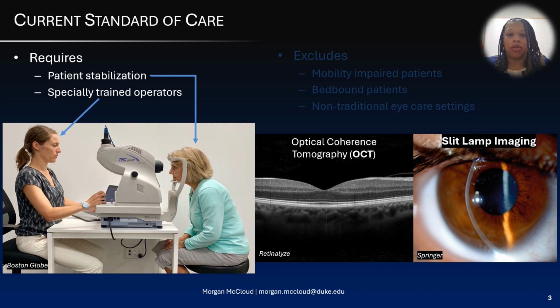This is typically used to image the back of the eye, our retina, and the layers of the retina are only 100 or a few hundred microns thick. This is very small, 10 to the -6 meters in terms of scale. So it is very important that we are always aligning our system with the back of the eye very precisely so we can get a high quality image for good diagnostics.